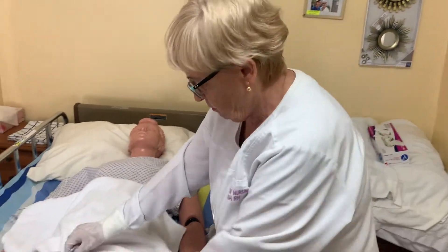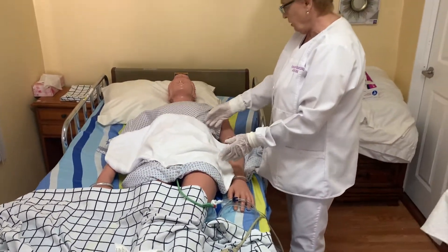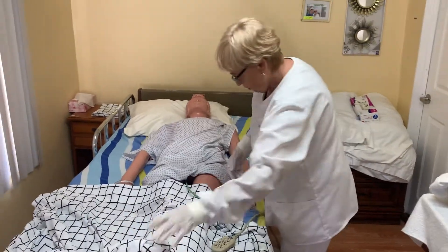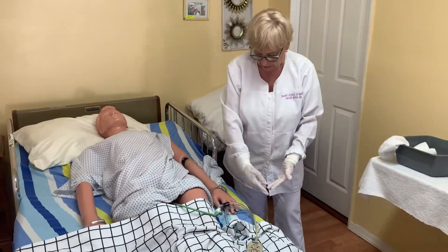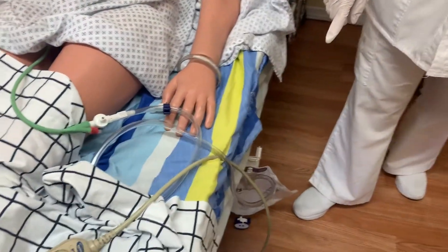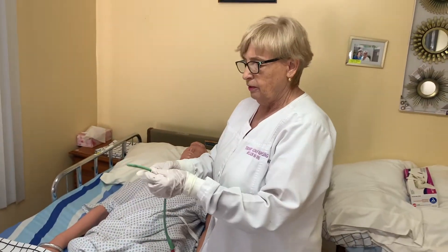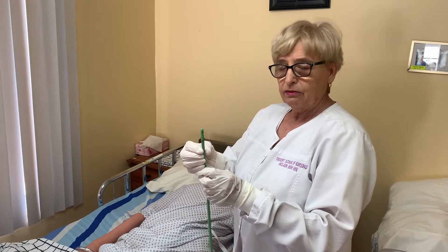I am done. Are you comfortable, Mrs. Green? This goes to the laundry. Check that the Foley catheter is patent — patent means you look to see if you have urine coming out through the tubing. If you don't have urine coming out, that means the end of the indwelling catheter or Foley catheter is clogged with some sediments, blood, or pus.